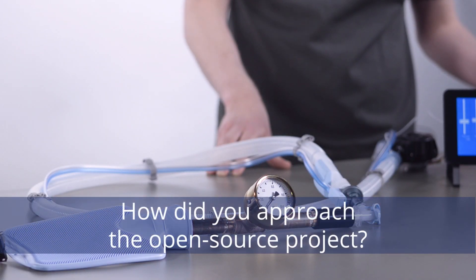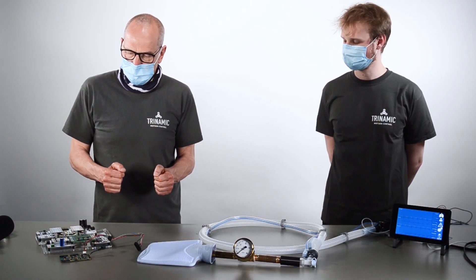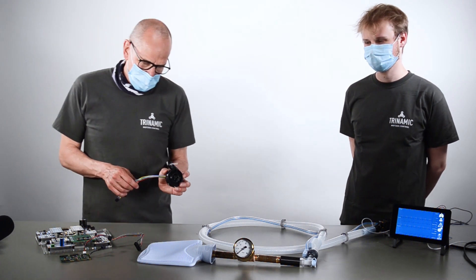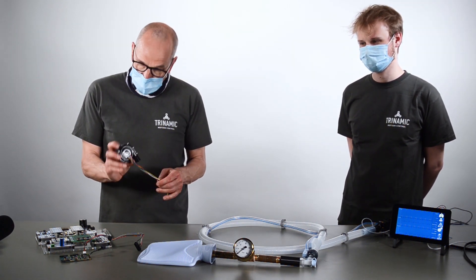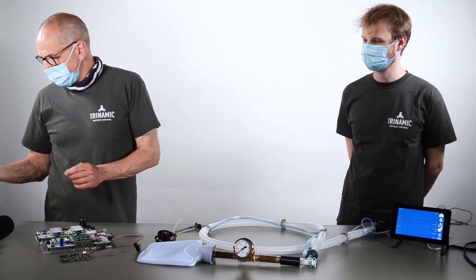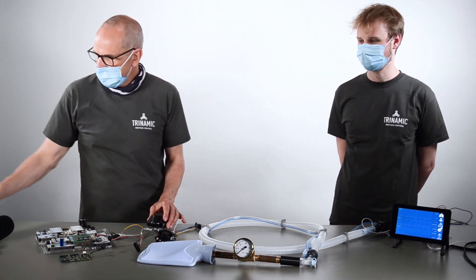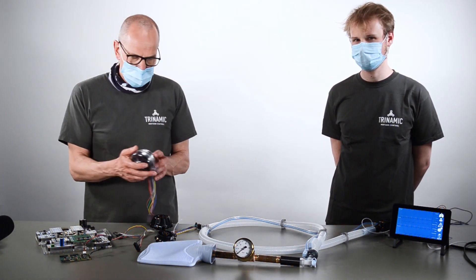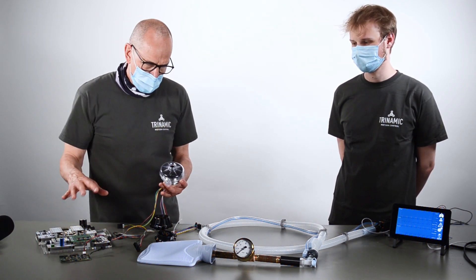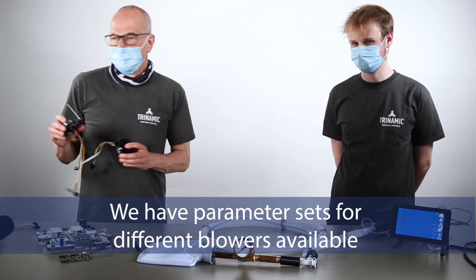We decided to go for a solution unlike others that compress an Ambu bag. We decided to go for a solution that is based on a blower. These blowers are available, they are mass-produced and they are made mainly for CPAP devices; others are made for real ventilators. All these devices can be driven by our board and they generate sufficient pressure for ventilation.